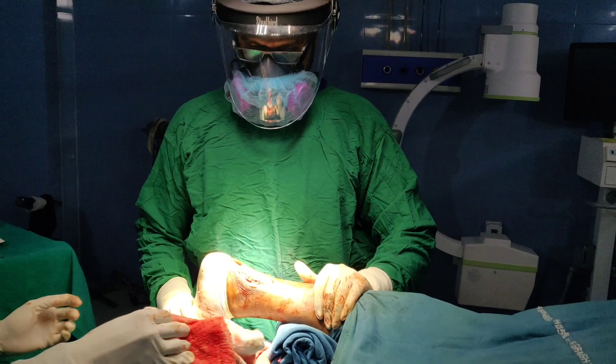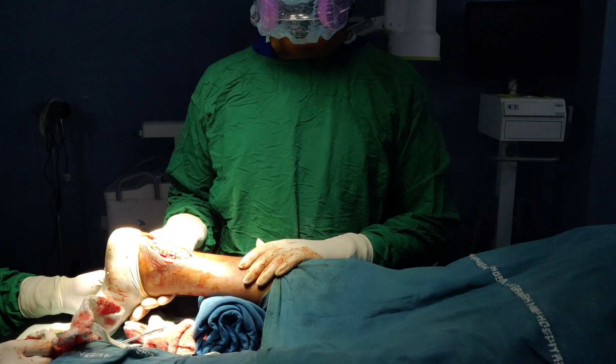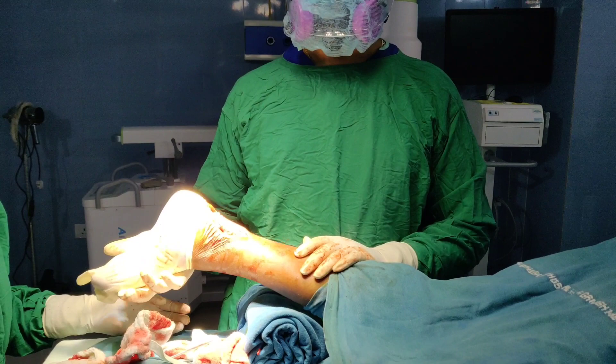Now I will wash the wound before closing. After closing the wound, I will apply a slab from the lower leg to the foot, keeping the angle in plantar flexion. I will apply the slab for the raising foot position. Thank you.